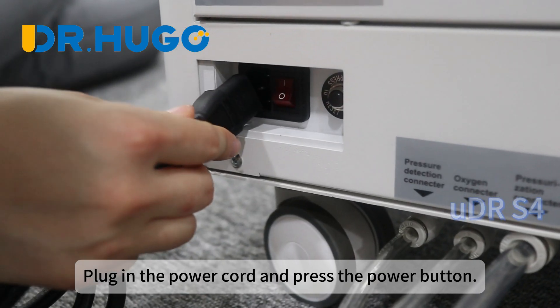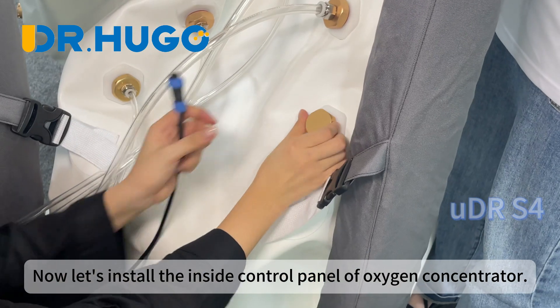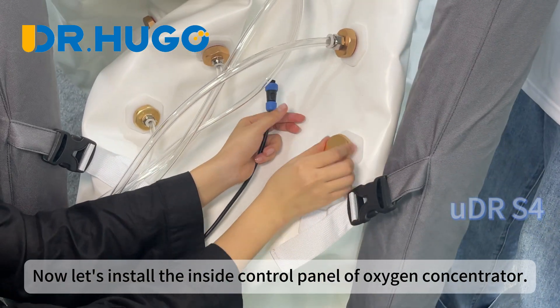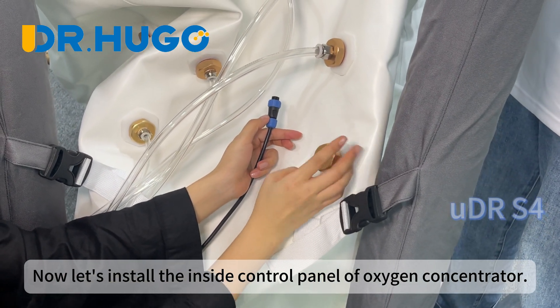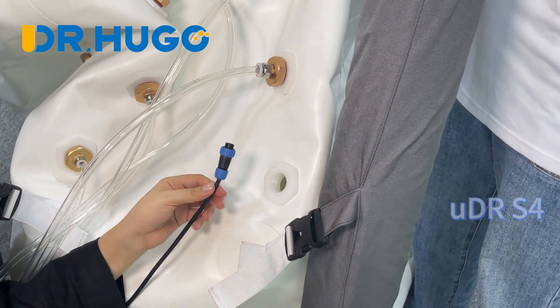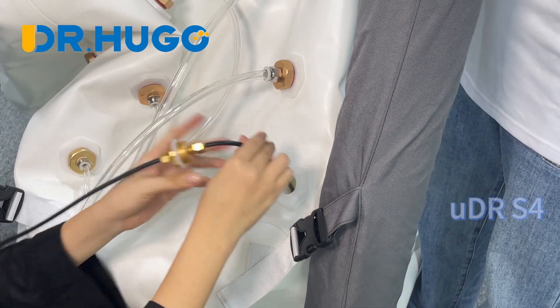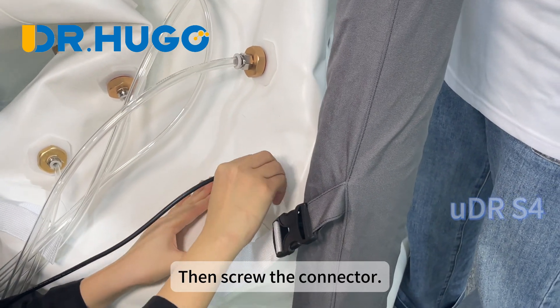Plug in the power cord and press the power button. Now let's install the inside control panel of the oxygen concentrator. Put the communication cable inside the chamber, then screw the connector.